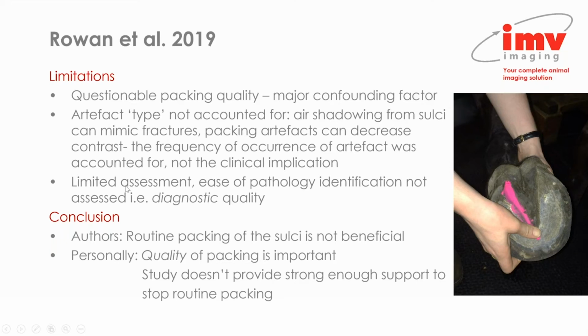Equally, it was a relatively limited assessment, looking at image quality using very basic grading systems, and the ease of pathology identification, or the differentiation between pathology versus artifacts versus normal, was not assessed. And so this study did not assess the diagnostic accuracy of packed versus unpacked views.